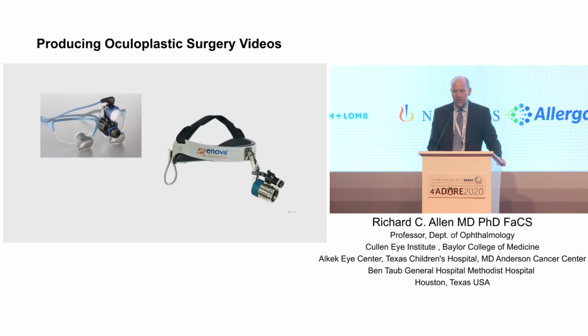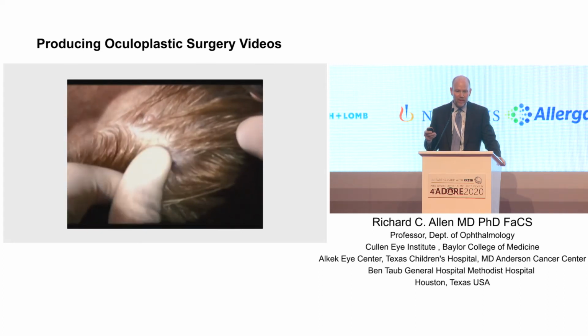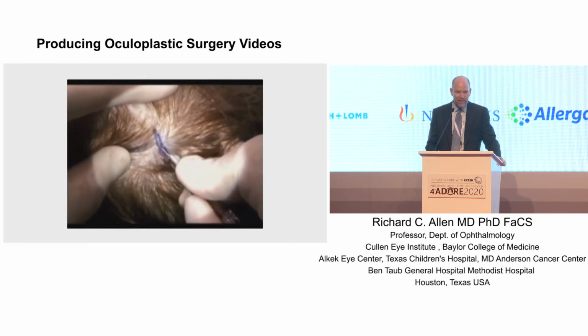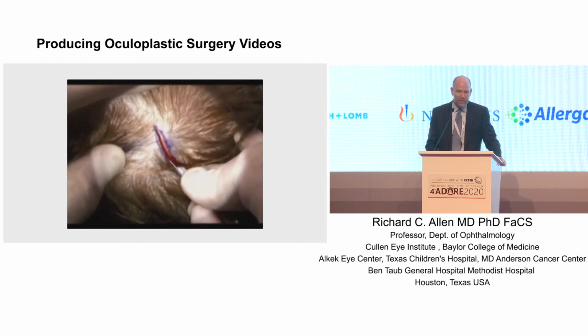So the other thing that you can do is you can use a headlight mounted camera. And the nice thing about this is that it's, again, almost videoing exactly what you see, but it's on your head and you have to keep your head still or people sort of get sick while they watch your video. So this is on my head. I have it with the light. It's in line with the light. So basically wherever I put my light, I know that I'm going to see the video.